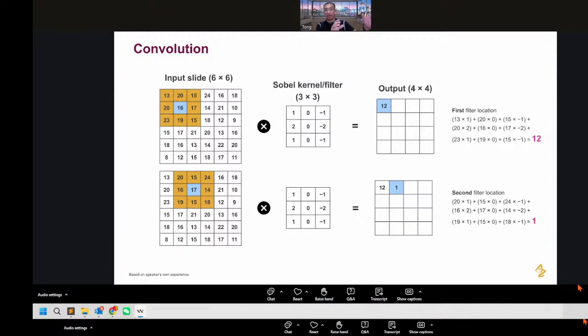So some models try to extract the key features from all the different small features and put them together. You can shrink and shrink, layer by layer, until it reaches a size that the computing can easily handle. That is the concept.